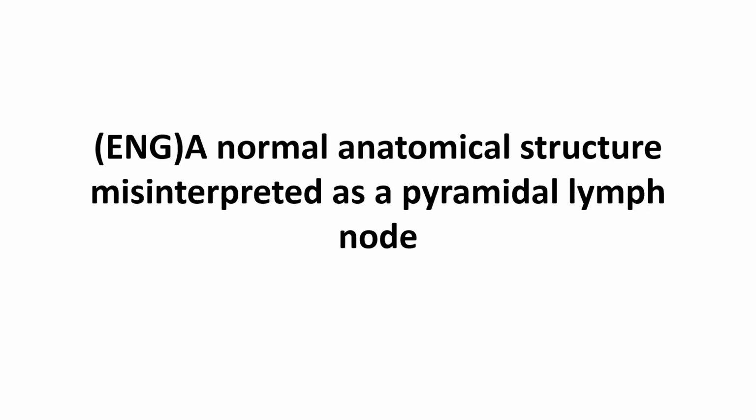Hello. Today, I would like to discuss a normal anatomical structure of the pyramidal lobe region that was misinterpreted as a lymph node.